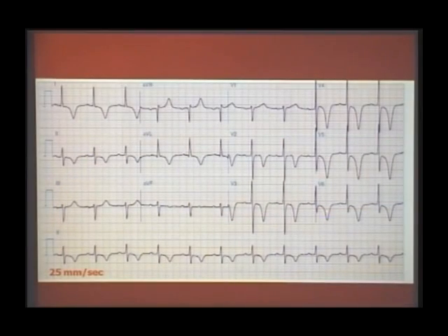So this ECG, have you seen it or not? Yes, this is one of the MCQs we gave you, whether the T wave direction is normal or abnormal. Here the T wave is abnormal because of the direction. The QRS is upright, but the T wave is negative. That's why the T wave is abnormal here because of the direction.